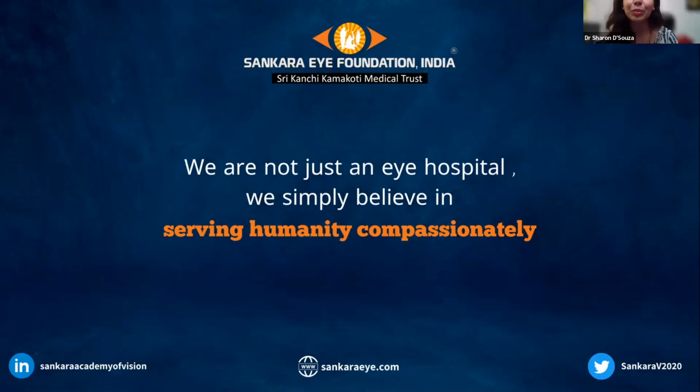And if you're getting the break in the same location repeatedly, what would that tell you? Spot. Yeah, it's just logic. Tell me, your thesis, you know it, I'm sure. Some localized defect. Exactly. Not defect necessarily, but some irregularity of the ocular surface in that area. So it tells you to go back and look.